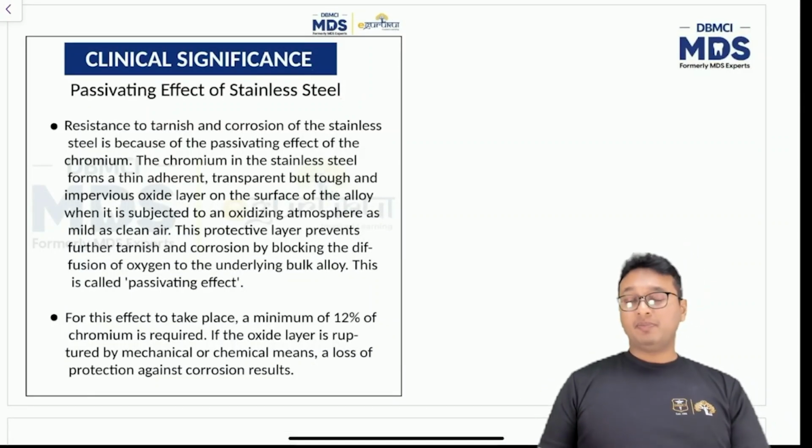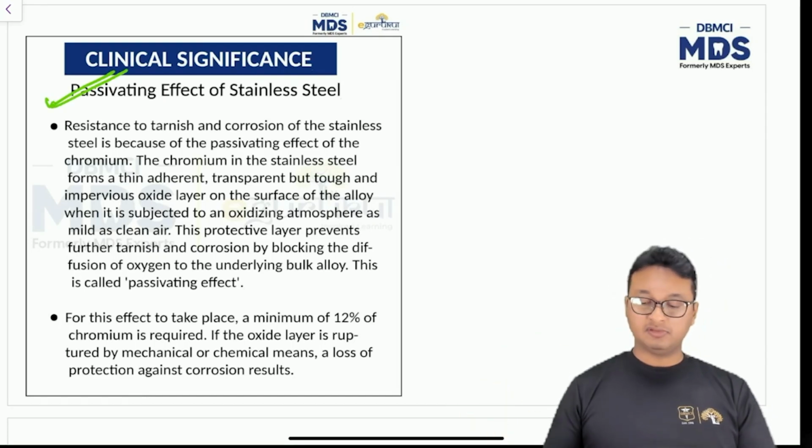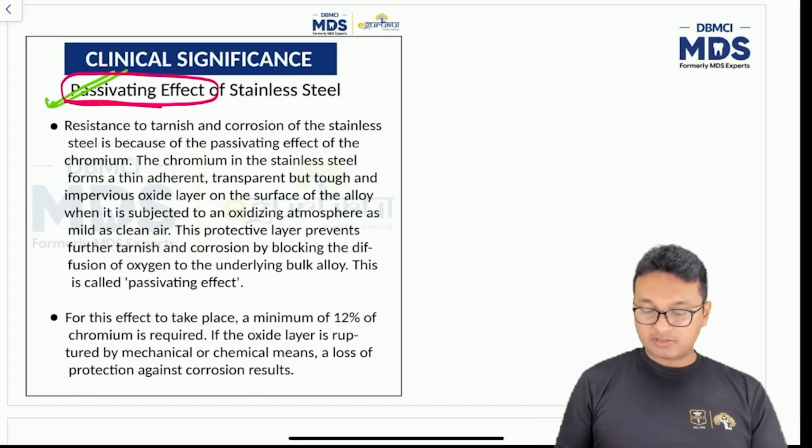Now, a significant property of stainless steel is the passivating effect. That is of clinical significance also in clinical practice. Now, what do you mean by passivating effect?